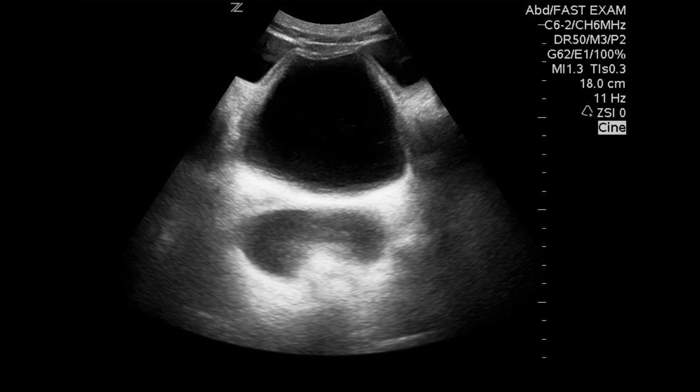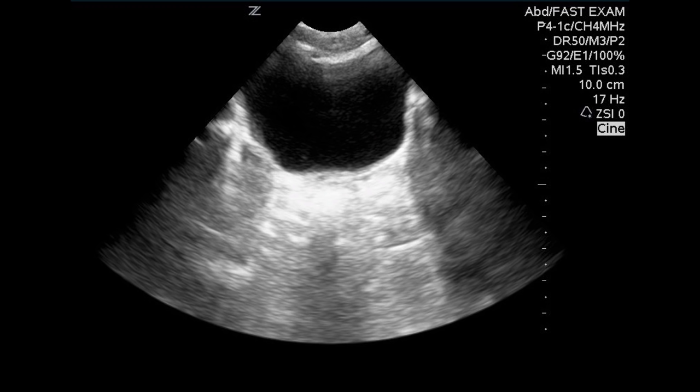Posterior acoustic enhancement occurs when there is a very low attenuating surface — this occurs at a fluid interface. Fluid does not interact with the sound beam as solid tissue does, so the sound beam remains very strong. When the echo returns from behind the fluid structure, it has not been attenuated as greatly, and the ultrasound machine interprets this as a greater signal, making those images brighter. Behind a fluid-filled bladder, the soft tissue appears very echogenic and bright — much more than surrounding structures.